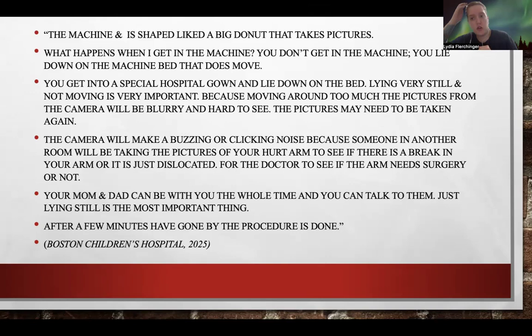So to make sure that you're wearing it so they can see throughout your body, and lying very still so they can see all the pictures very clearly. So then once you're on your bed, you're very still, and the bed goes through the big donut hole.